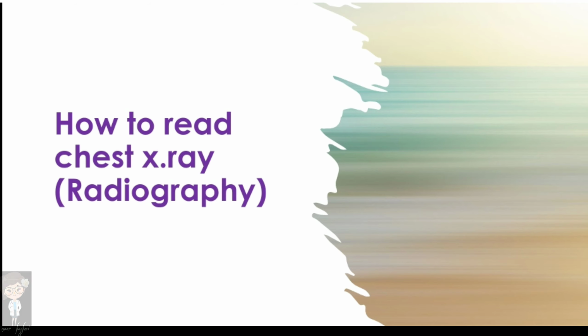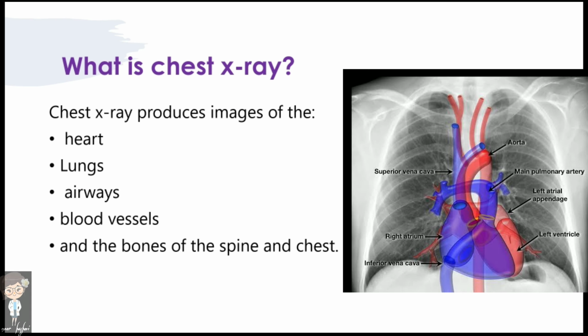Today we will talk about a very important topic of radiology, which is reading chest X-ray. It will comprise various other topics like diseases diagnosed by chest X-ray, which organs can be seen in chest X-ray, and benefits and risk of chest X-ray along with chest X-ray reading steps. First of all, we will see what is chest X-ray.